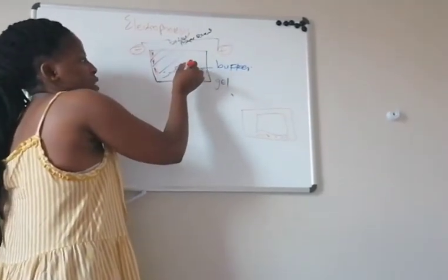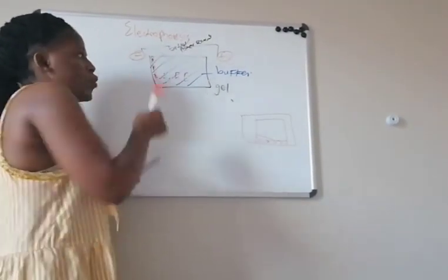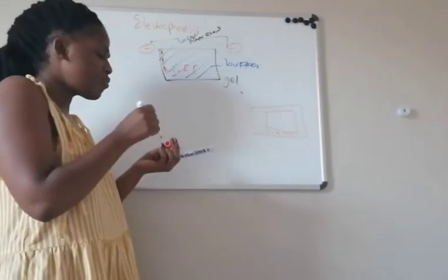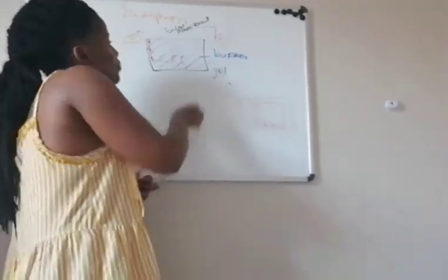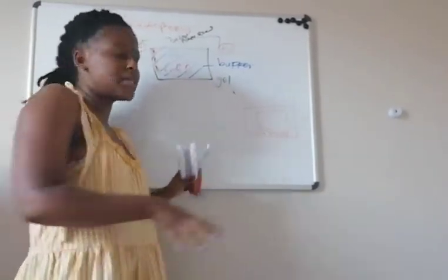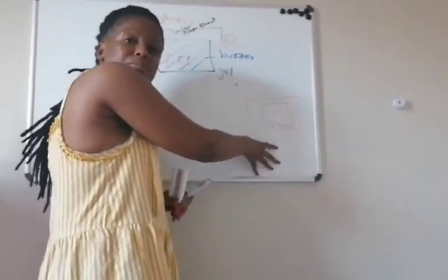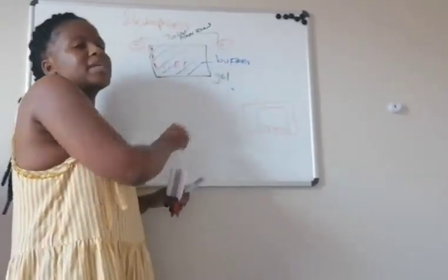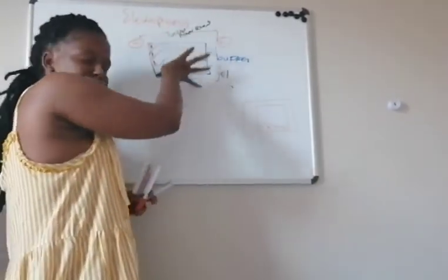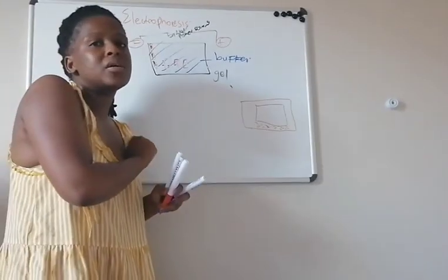So we will see the migration with bands, and these bands are the ones that are going to be calculated by the quantification system to determine how much of that specific protein or that lipid is present in that patient sample.